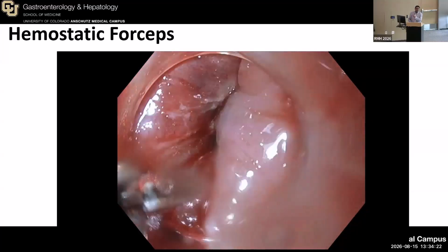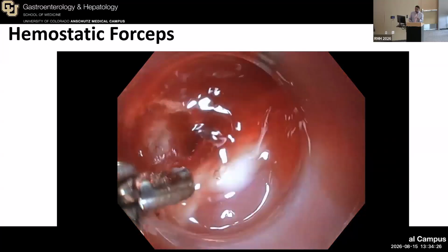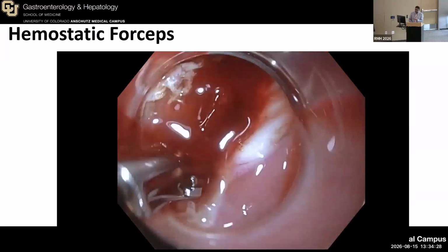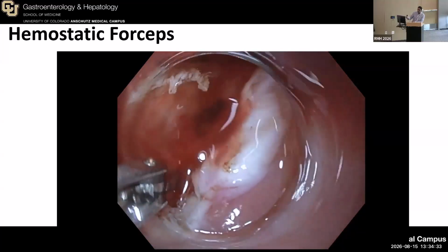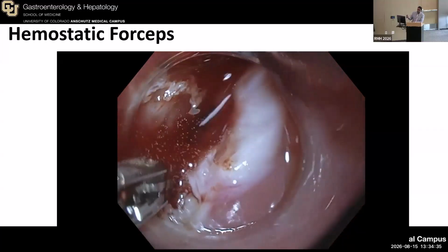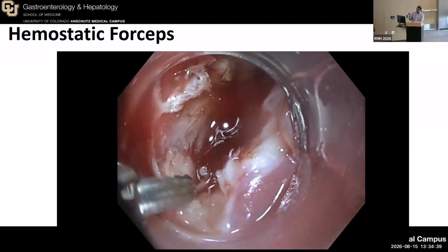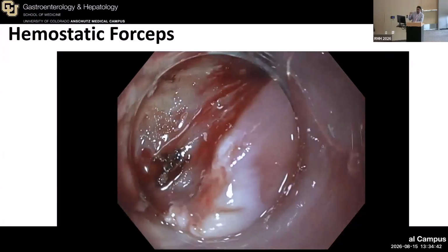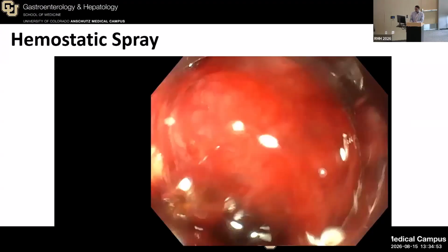Now I tent back so that the cautery is not hitting the muscle. And then you just press on the coagulation pedal, and then you'll get hemostasis. This, as you can see here, once we isolate this vessel, is a big vessel. You can see that this is an artery. So once you grab it, I tent back, all of a sudden bleeding stopped, and then I just put on the blue pedal, making sure of coagulation, tenting it away, and then you get hemostasis. So again, these things can look very stressful, but if you can visualize, my first principle, and then second, know what's in your toolbox, you can manage most of these bleedings.